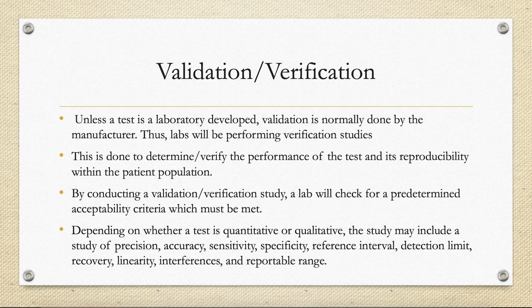Depending on whether a test is quantitative or qualitative, the study may include a study of precision, accuracy, sensitivity, specificity, reference interval, detection limit, recovery, linearity, interferences, and reportable range.